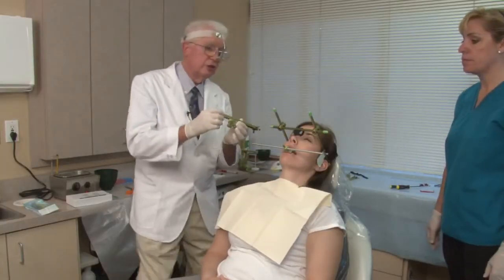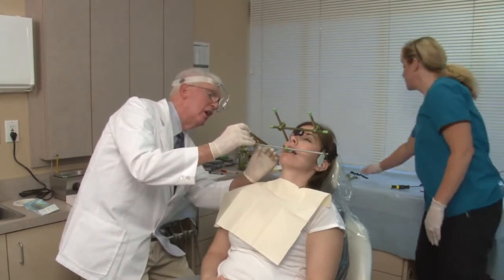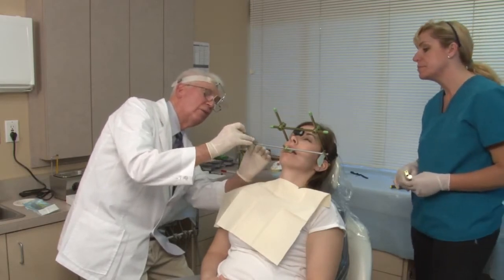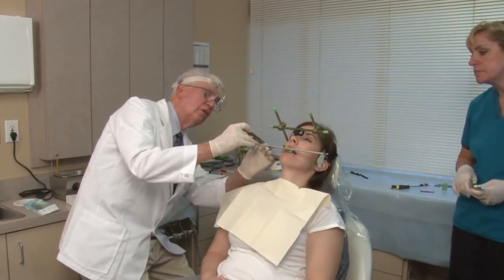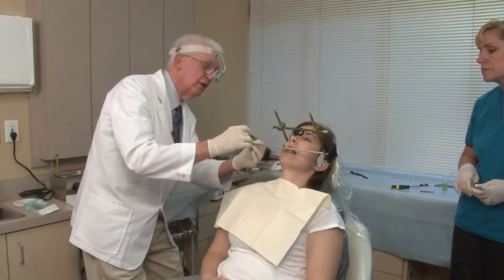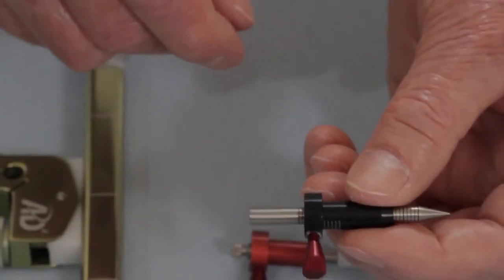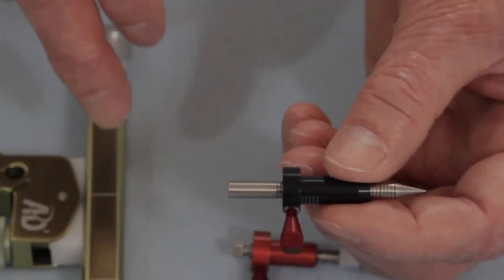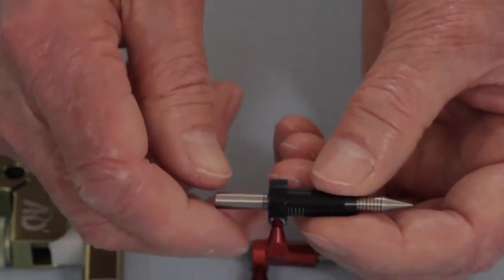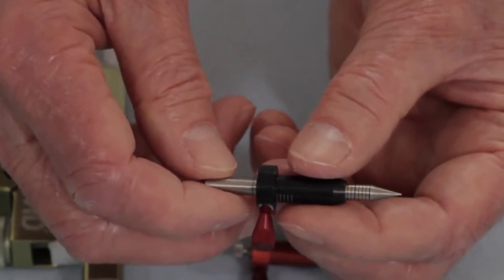And the first thing I do is I just take a quick look at the sidearm and judge where it is in relationship to the flag to see if I can make any gross movements before I actually put it onto the patient. This looks like it could go back a little bit. It's important that the sidearm be set at the proper distance from the flag assembly in order for the writing pencil to work when you start recording the movement pattern of the patient.